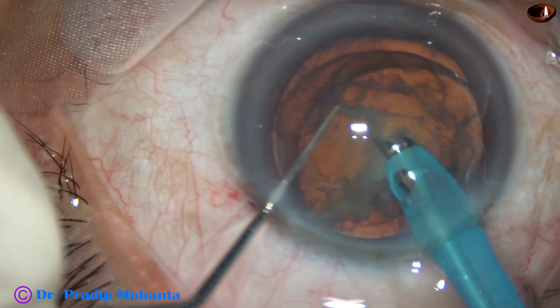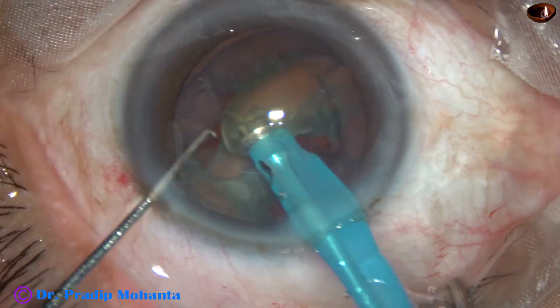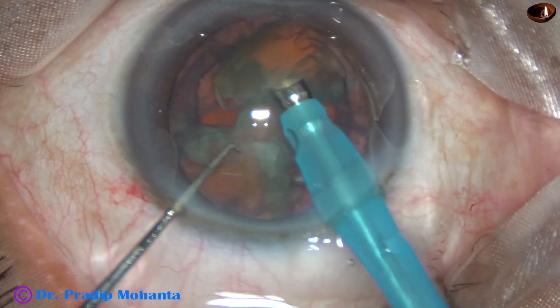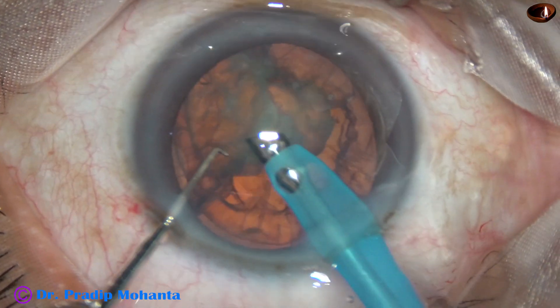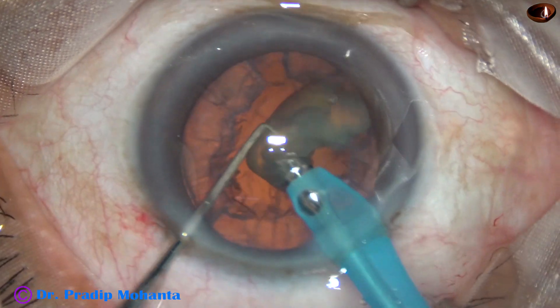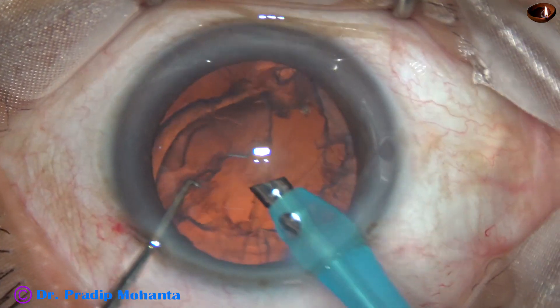Now, this is the other hemi nucleus. It has been divided into two parts. Each part is then being emulsified with ultrasonic energy and removed. This is the last nuclear fragment.